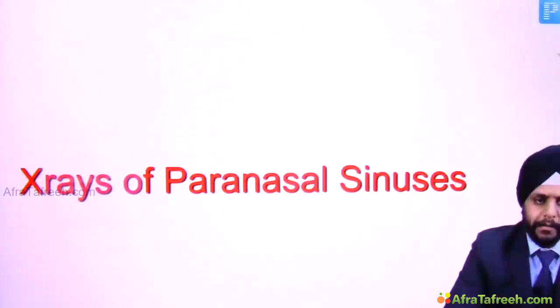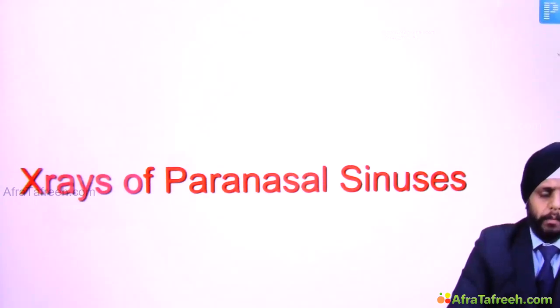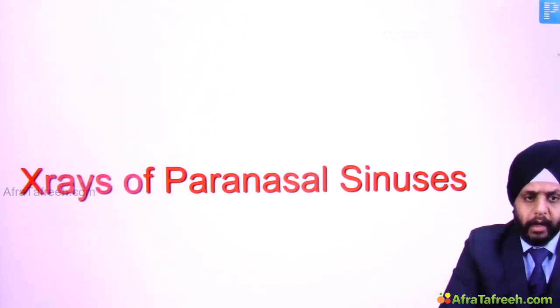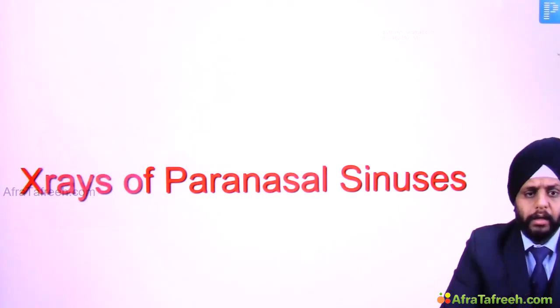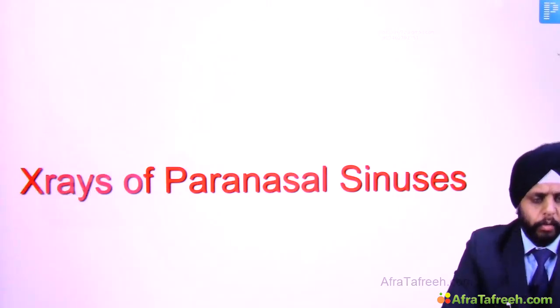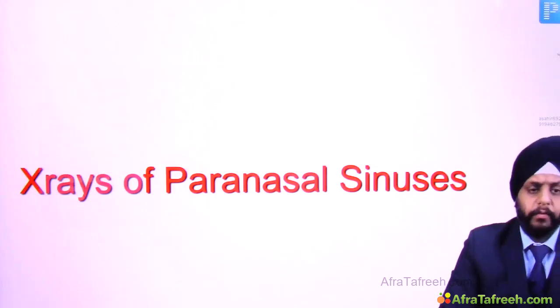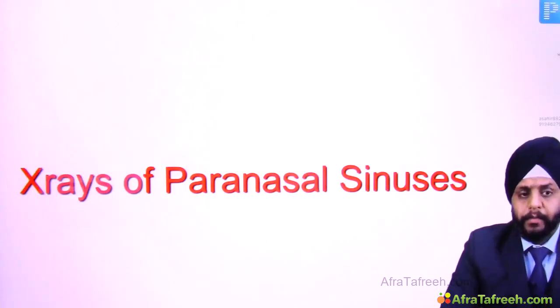Let us now discuss the X-rays of paranasal sinuses. Before I start this topic, let me remind you that these X-rays are nowadays clinically obsolete. We don't use them in clinical settings these days. But I'm teaching you this topic because it's a very important topic for you in the MCQ exams.